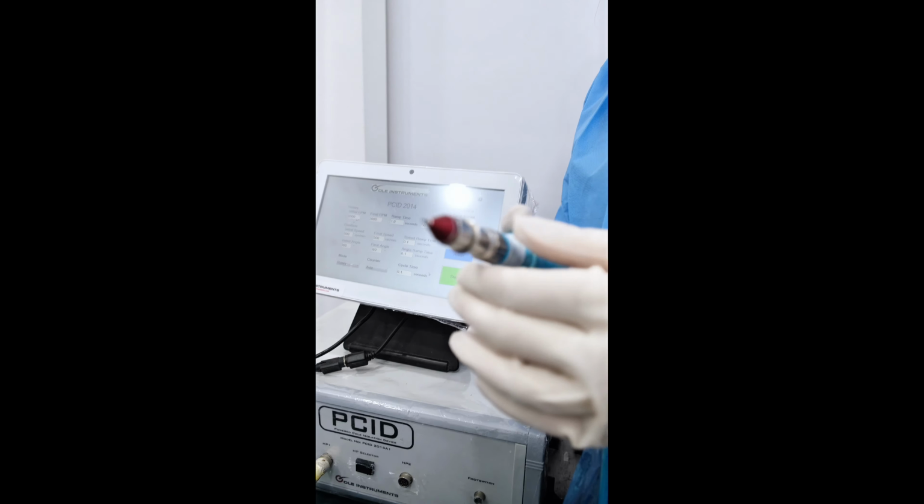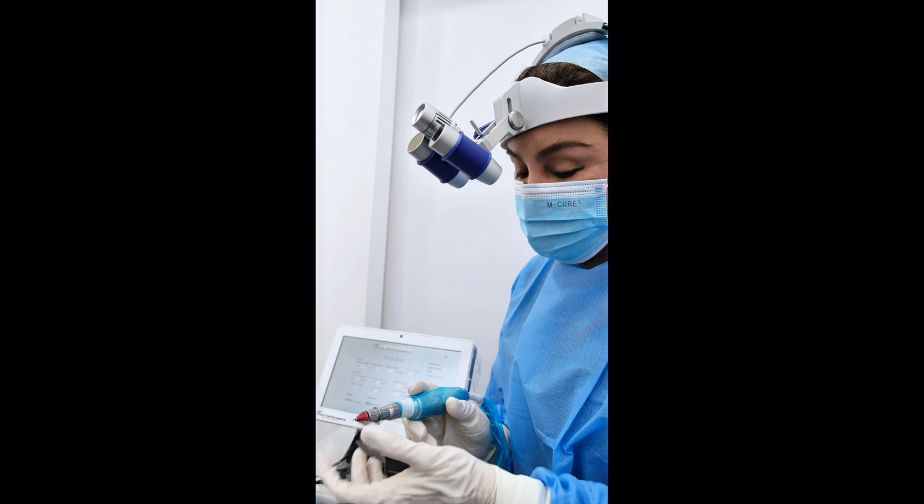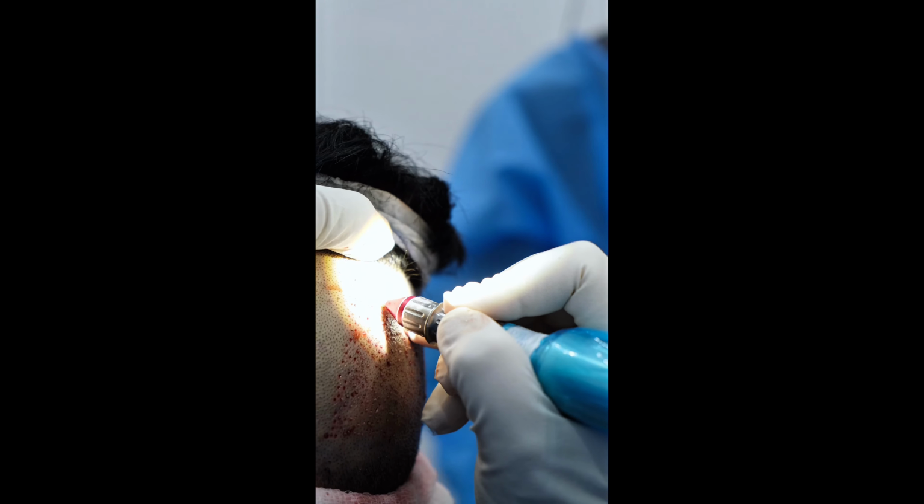When you talk about punches, this is where we talk about the size of the punches. It can be 0.7 mm, 0.65 mm, 1.1 mm. So this is the size of the punch. And normally, to know the height, we do the harvesting, we extract the graft, and then we measure the length of the follicle, and therefore we can adjust this. You can just turn this and adjust the length so that the graft comes out very smoothly.